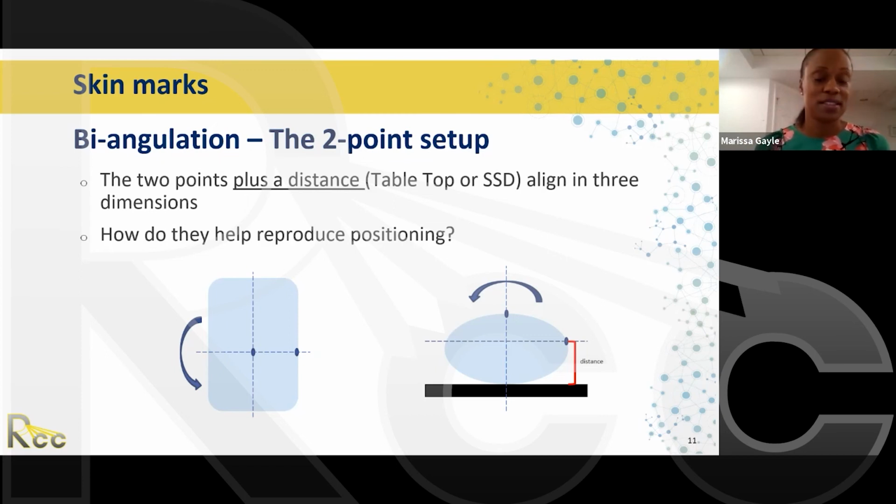Try and give them deep breathing techniques. Sometimes that doesn't work. And sometimes, depending on what we're treating, I have to cut a little bit more of the mask out for them to get them through it. I do not want to compromise the integrity of the mask, so I definitely don't want to cut out, let's say, the nose. I do not want to cut out the chin, but I've definitely cut out the eyes. I've made a little hole where the lips would be so they feel like they can breathe through their mouth.